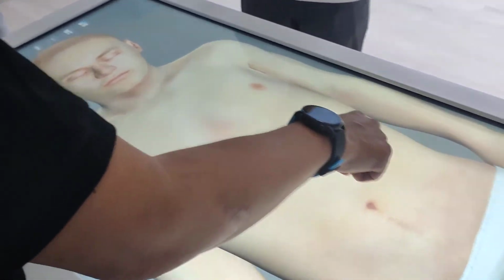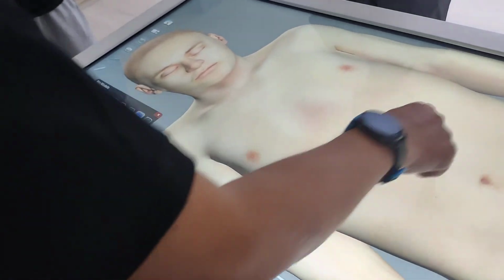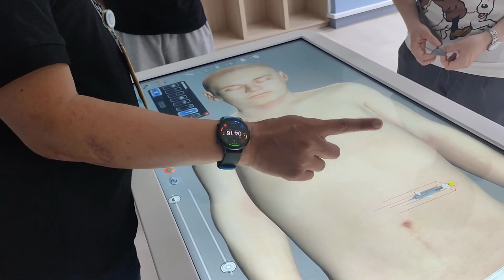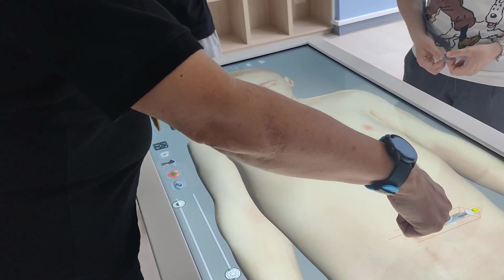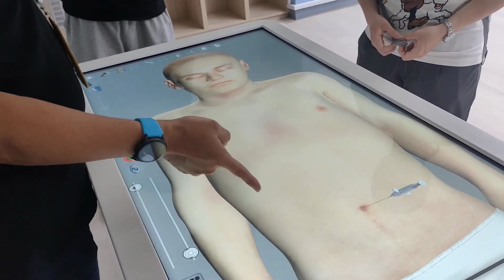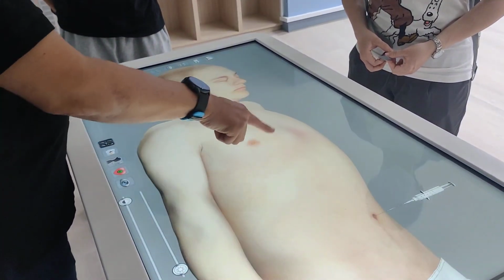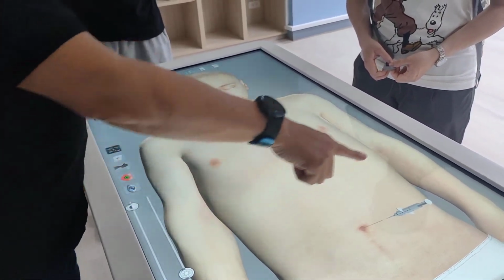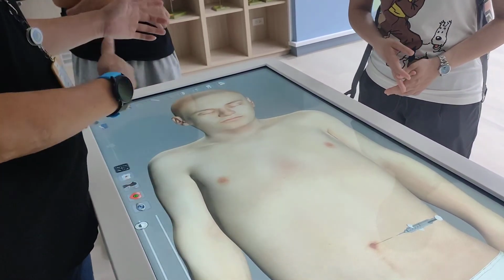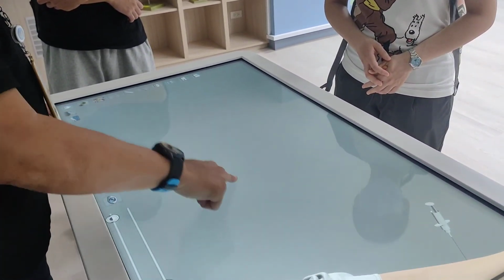And this one is the pointer. So, for example, if I want to use this like this one, so I can use this pointer as an indicator. So, for example, I want to show people this is the umbilicus. Okay. When you move the cadaver, it will move. Right, and this won't. This pointer is not going to leave away from the cadaver. So you can see.